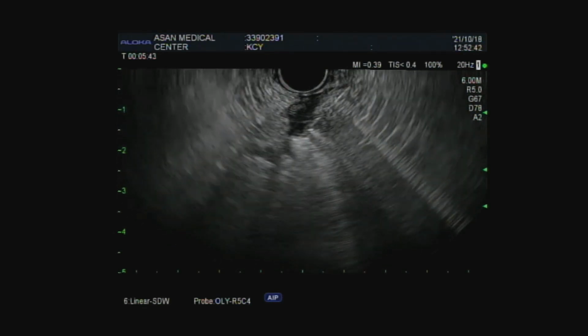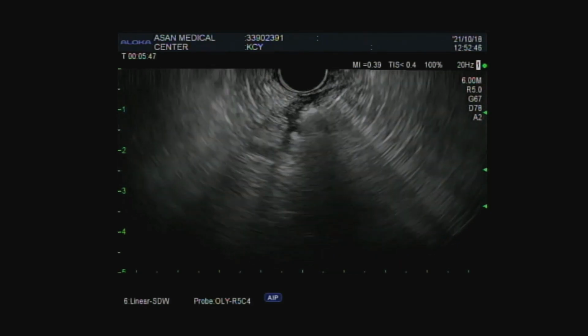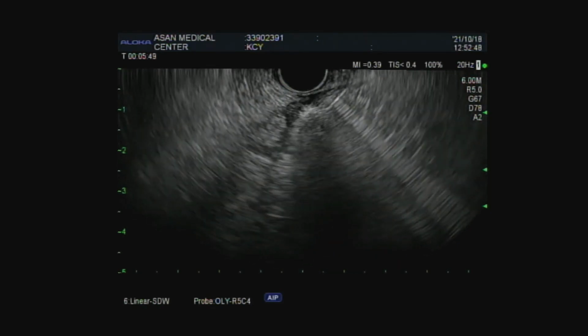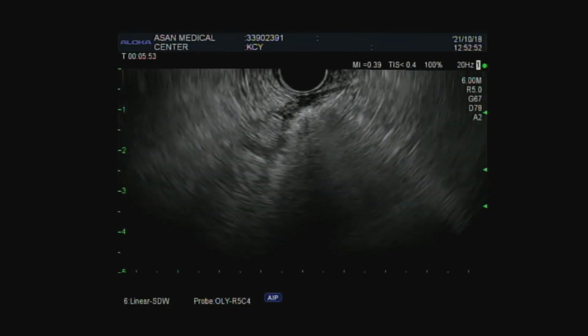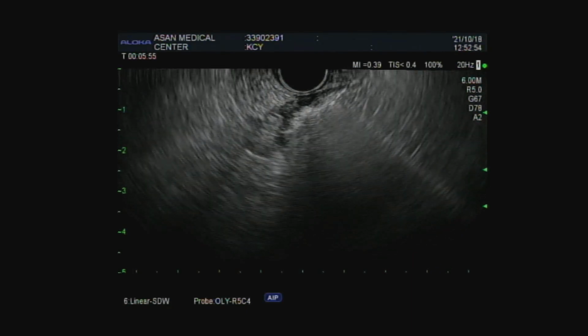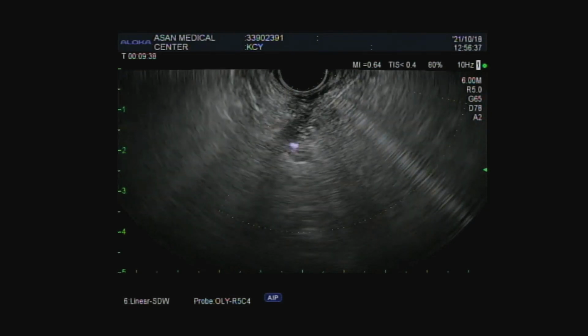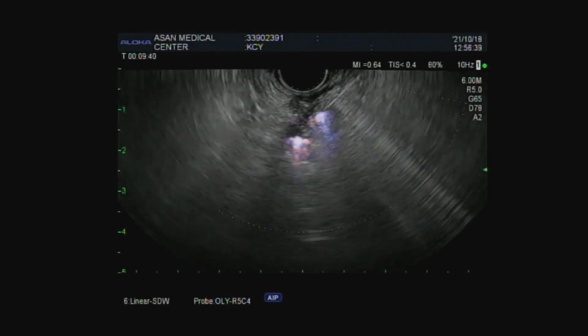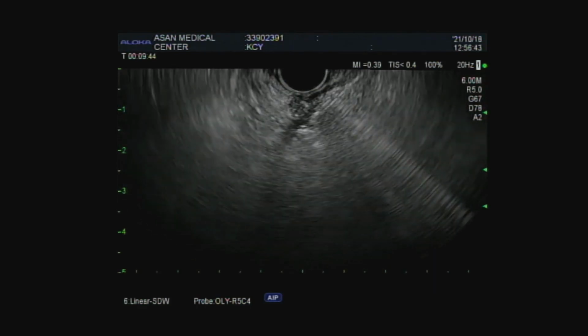Now we can see echogenic cloud formation near the active electrode part. It is a 1 cm electrode. After one site ablation, we changed the needle direction to a non-ablated area and created another ablation. If you want to see the real ablating zone, applying E-flow image is quite helpful.